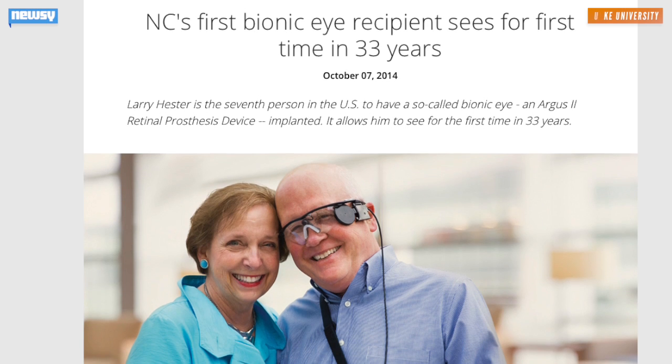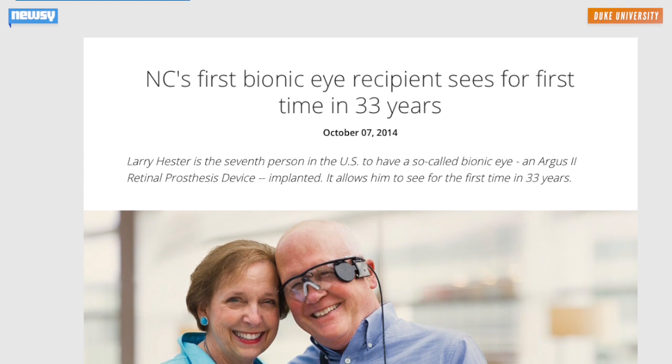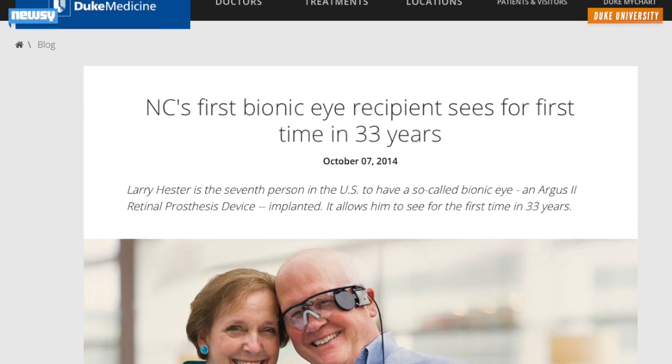The Argus 2 interprets footage from a video camera. A retinal implant sends the signals as light patterns to Larry Hester's brain. The light is so basic and probably wouldn't have significance to anybody else, but to me it's meaning I can see light.